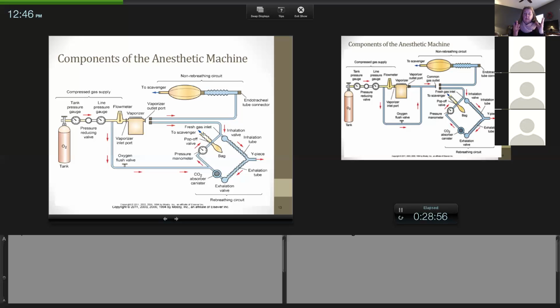So the reason I'm stressing that is that's a perfect anesthesia board exam question. Like, well, first of all, which system do you have more control over? Obviously the precise. What is the downfall?